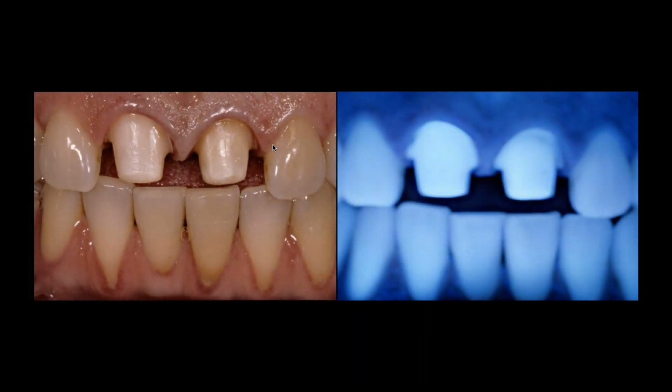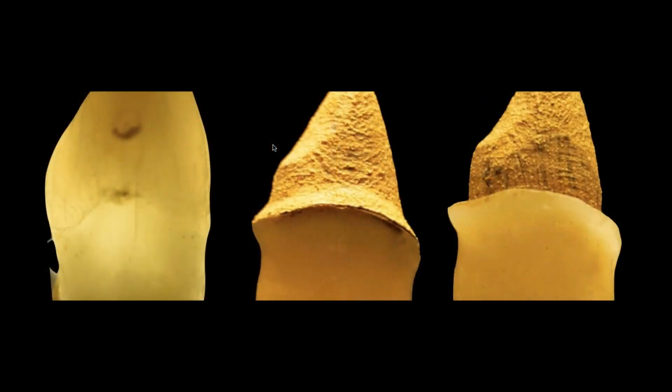And in nature, not only do you have light transmission, but you have opalescence and fluorescence, things that we have in ceramics. I would argue they're not as great as nature, but they're close. They're getting better and better every day. And especially with some of the newer systems that we're getting into, you'll see how that's better.